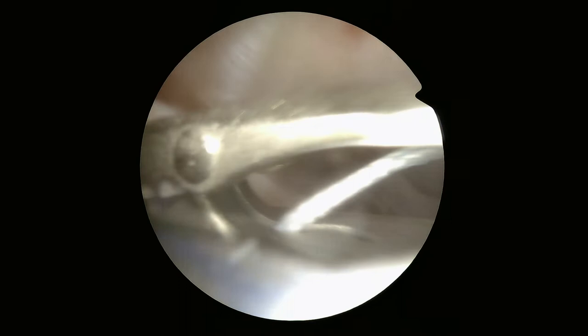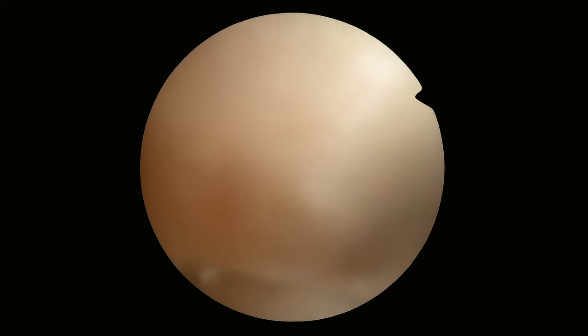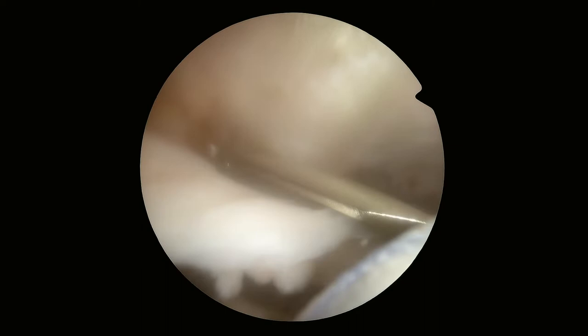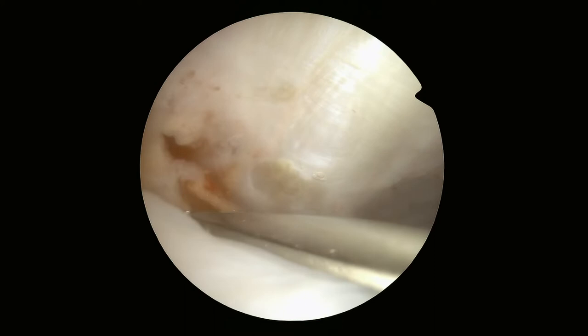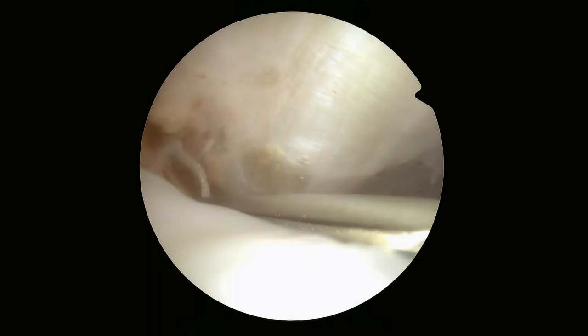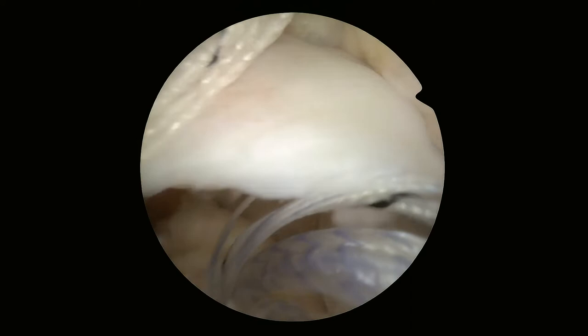We're going to pass those sutures through the rotator cuff. This is a little passing device that basically shuttles a stitch through the rotator cuff. We're finding the correct spot, pull the trigger, and that delivers a passing stitch through the rotator cuff. The first one misfired, but the second time I passed it and pulled it back out. Now that first stitch we use as a shuttling stitch to pull all of the sutures from that anchor through the rotator cuff, only having to pass a needle one time through the cuff.